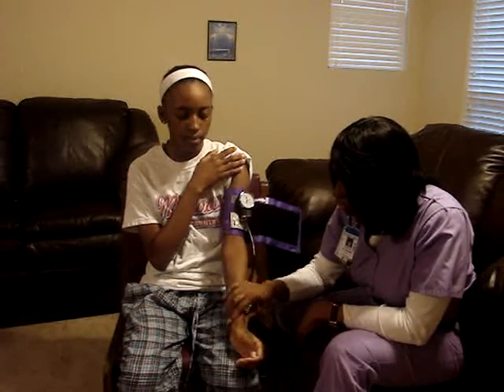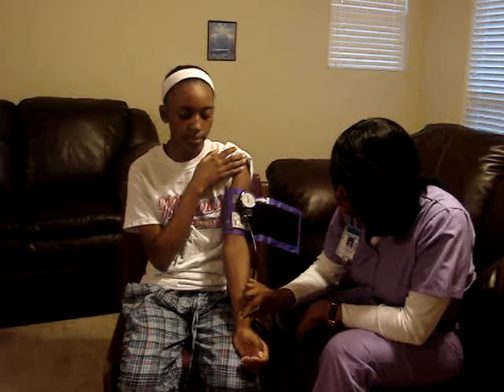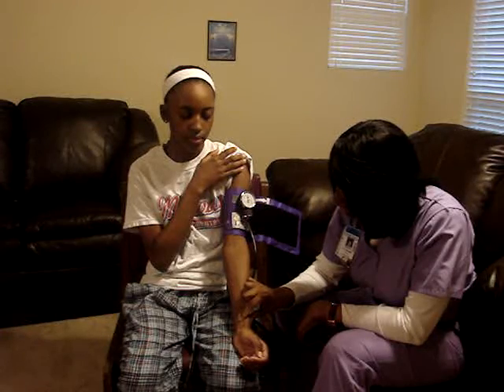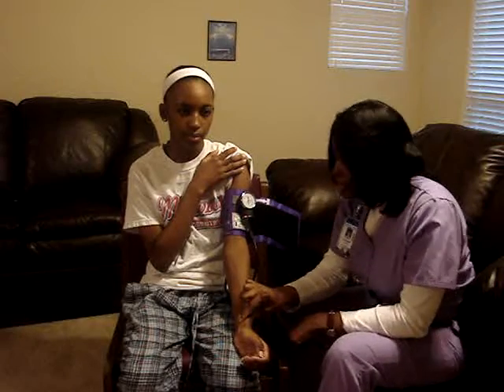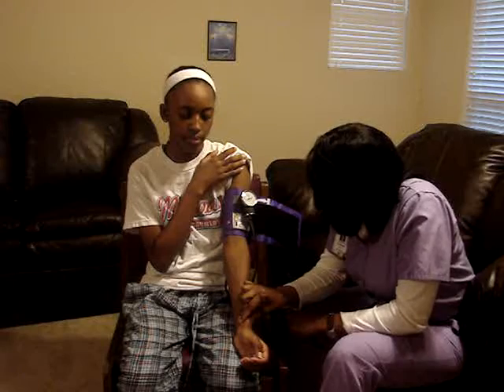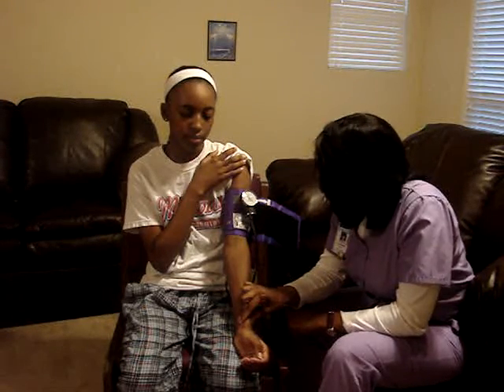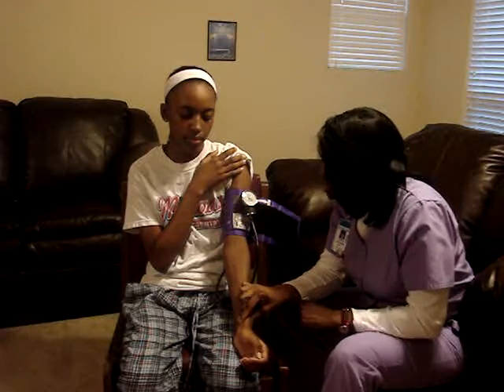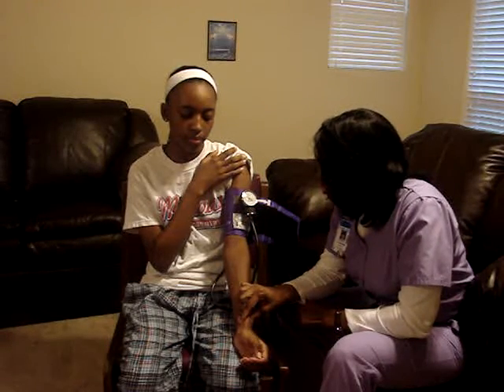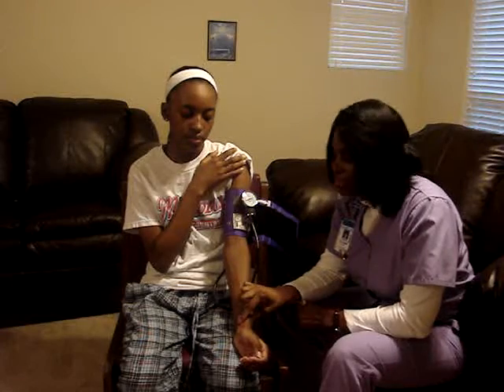Just relax your arm, Hillary. Keep it nice and relaxed. And I feel it. So what I'll do is pump up the blood pressure cuff until I can no longer feel that. And I don't feel it. Once I get to 120, I don't feel it. So I'm going to slowly let the air out till I start feeling it again.